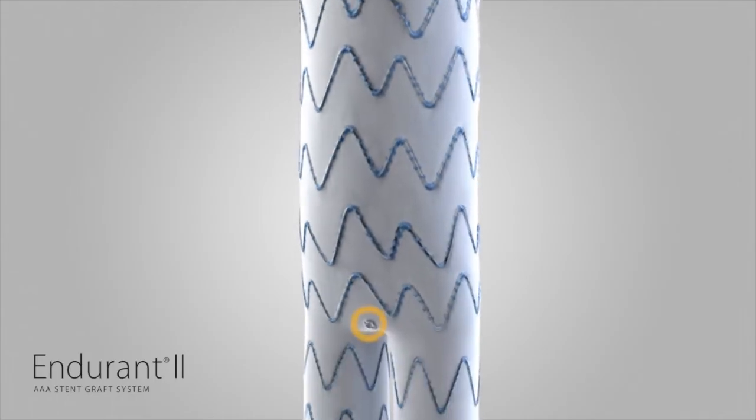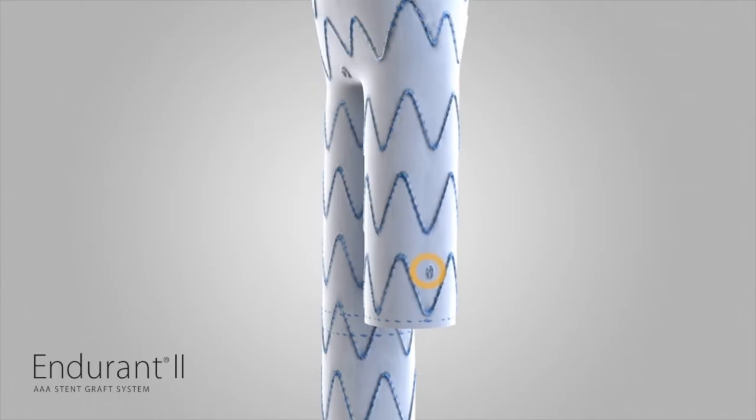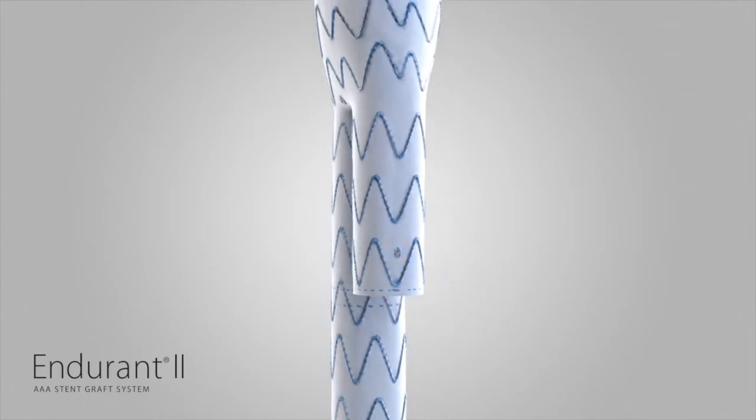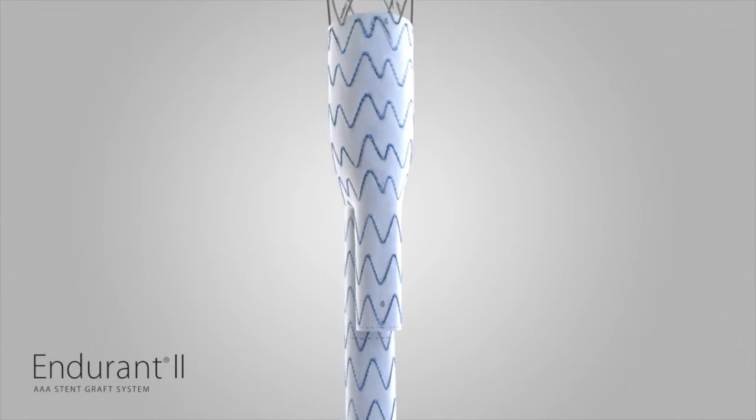There is also a flow divider marker at the center of the bifurcation and a marker at the end of the contralateral stub leg. Use the marker on the contralateral stub leg to locate the contralateral gate before deployment.